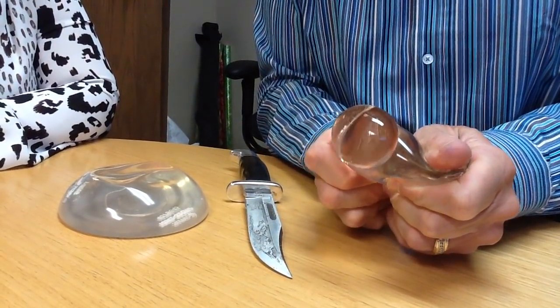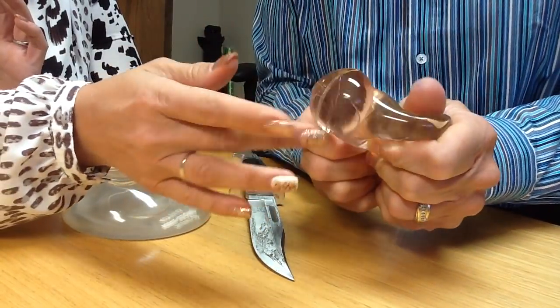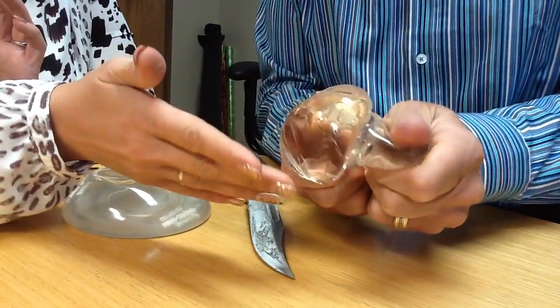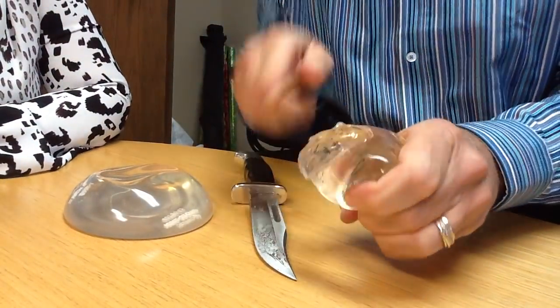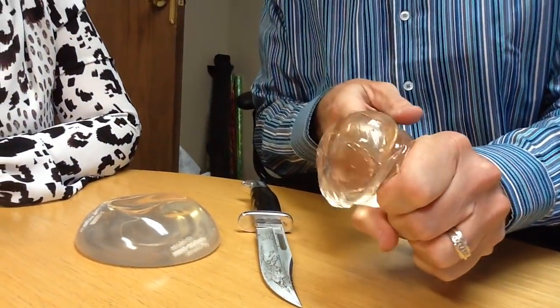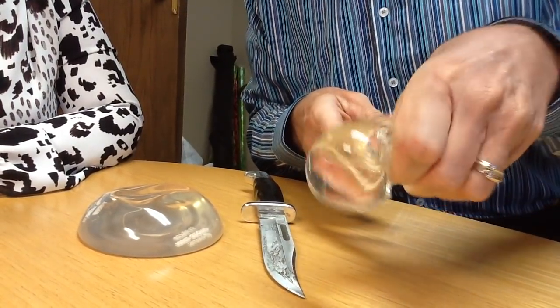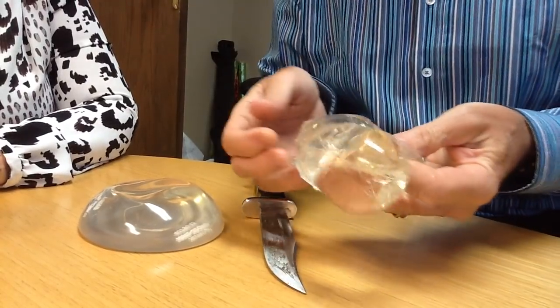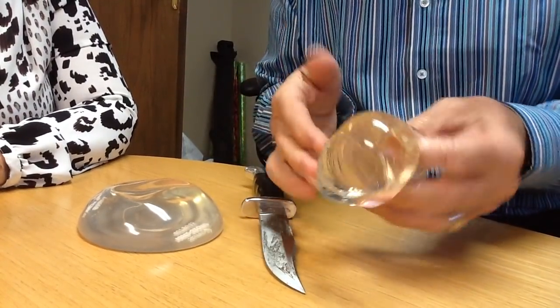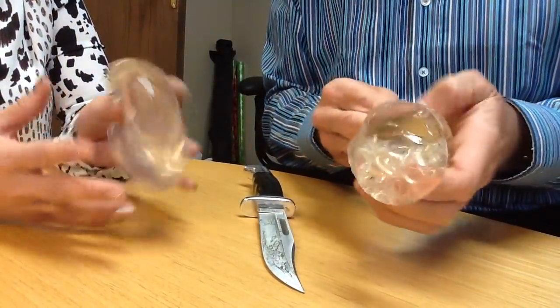When we squeeze this out — that's what would be going into your body. It's somewhat cohesive, a bit sticky, so it's not like it spreads throughout the body. The body actually puts a scar tissue shell around it, but it tends to want to come out and get deformed. This can lead to a change in size or shape of the breast — if this ruptures, that's what you'll notice.